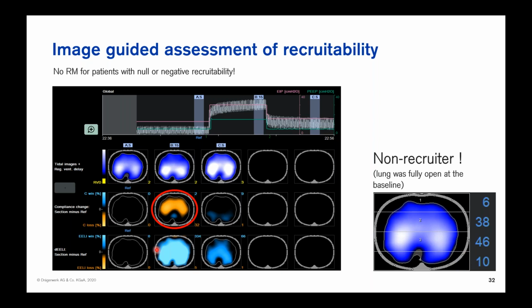When you take a look at the increase of end-expiratory lung volume, of course, you see an extremely high increase of the lung volume while you have increased the PEEP, but that increase is mainly induced by the elevation of PEEP, which basically keeps more lung volume inside the lungs at the end of expiration. If you go down with the PEEP again, you still see that you have gained a certain amount of lung volume, even though the PEEP level before and after this maneuver was kept stable.